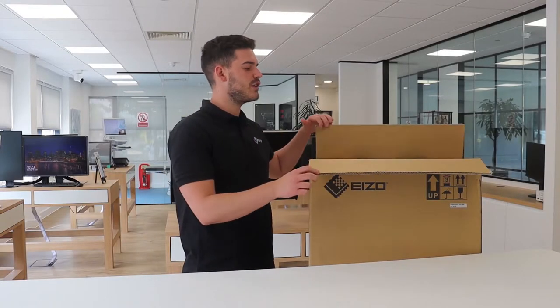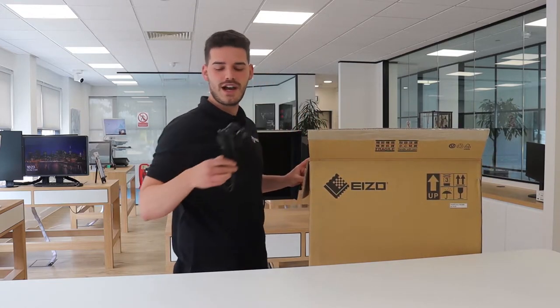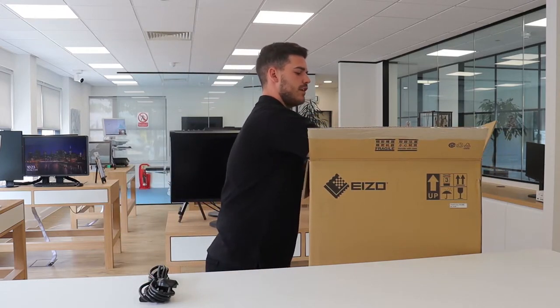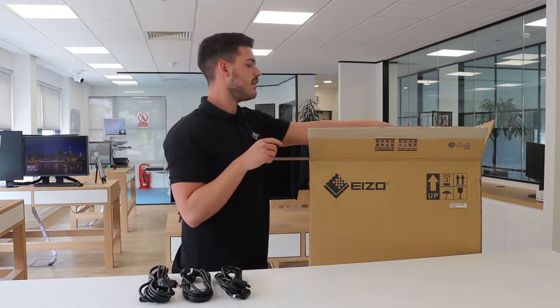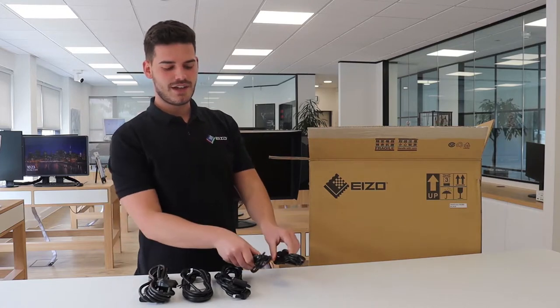Once the box is opened you'll be greeted by the cables that are included. First off we have a UK power cord, followed by two DisplayPort to DisplayPort video signal cables, and finally two USB-A to B cables.